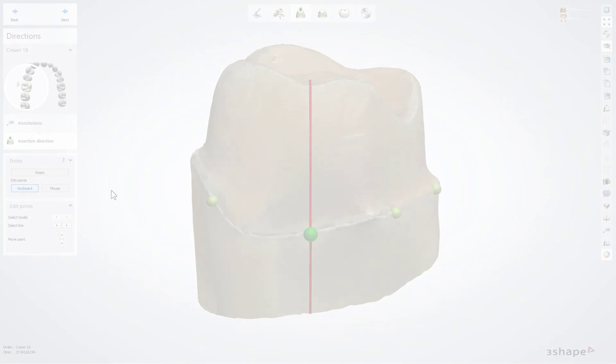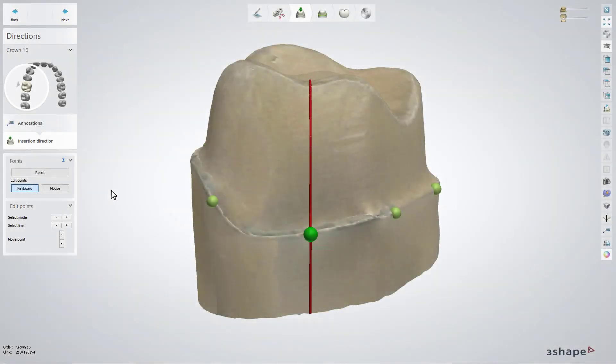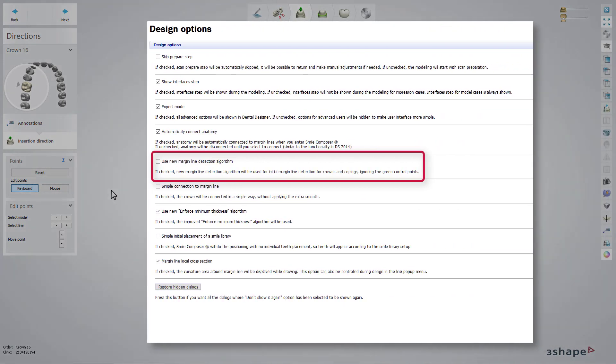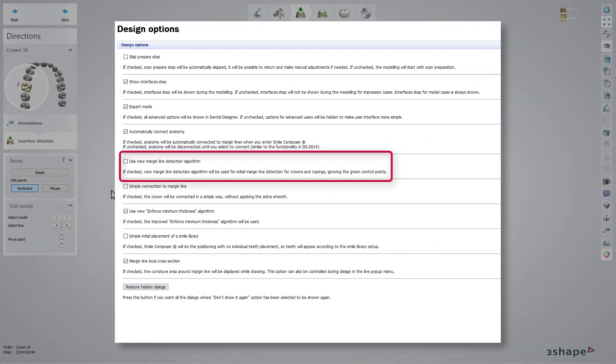In this video we will show you the margin line settings in Dental System. The margin line identification starts in the Insertion Direction step, where you need to indicate the edge where the margin line is. You can preliminary select the margin line detection algorithm in Design Options of the Control Panel within the Use New Margin Line Detection Algorithm option.